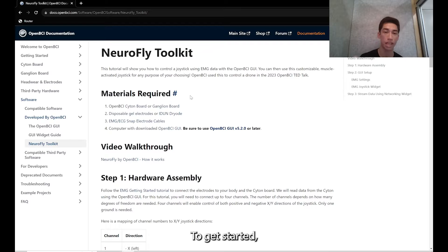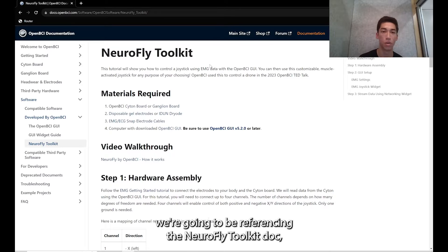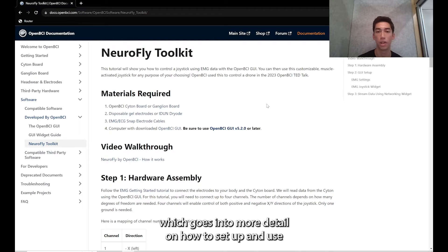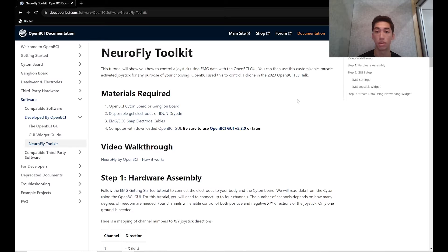To get started, we're going to be referencing the Neurofly Toolkit Doc which goes into more detail on how to set up and use the EMG joystick.